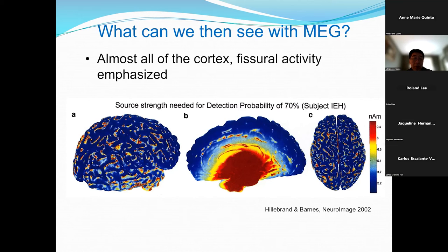Number one, it's very deep. Number two, the cell orientation is like spaghetti. But MEG is very sensitive to all of the cortical level and many subcortical gray matter structures like the hippocampus, amygdala, and the insular cortex, many regions. I'll show some examples later on in my lecture.